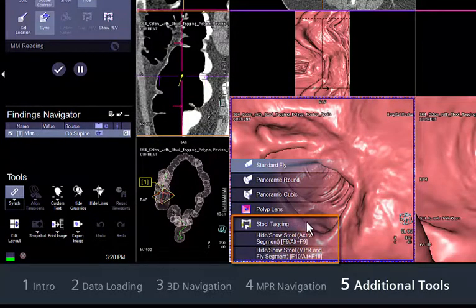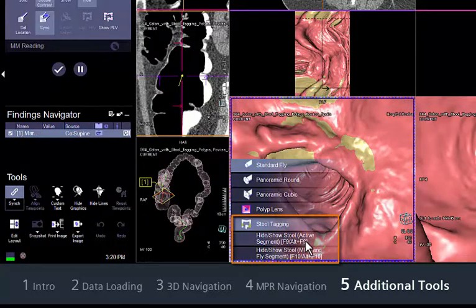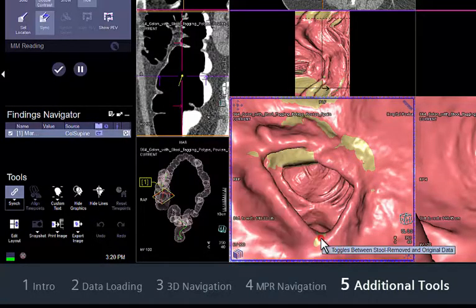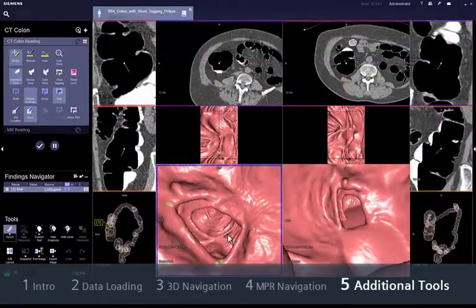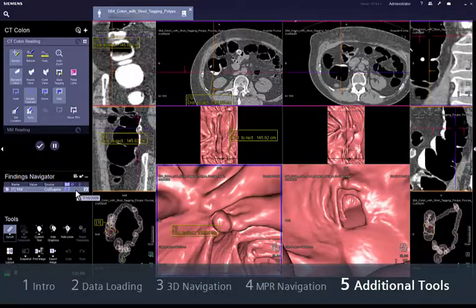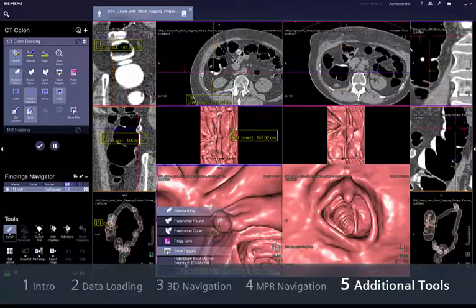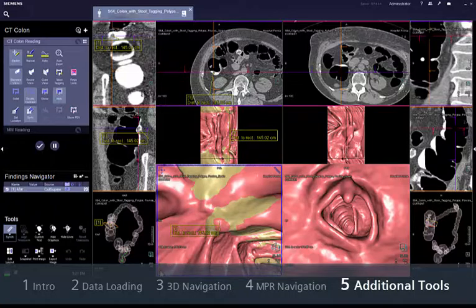In the lower left corner menu, you will find options for tagging or removing stool in case oral contrast medium was used for colon preparation. They allow you to easily differentiate a potential polyp from stool in the endoluminal view.